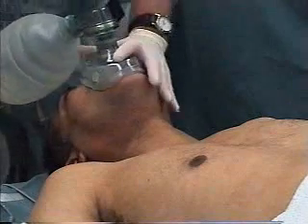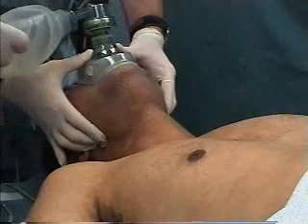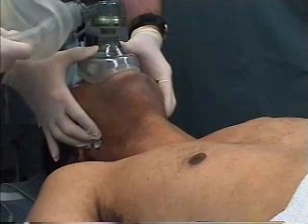If there's a leak around the mask, use 2 hands to hold the mask and have an assistant squeeze the bag. If you're still unable to ventilate, the patient must be intubated.